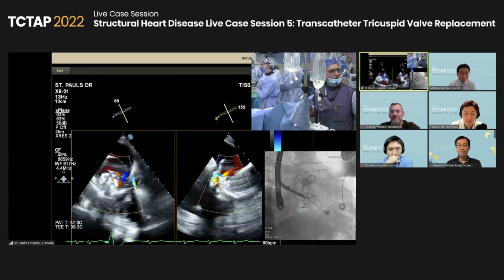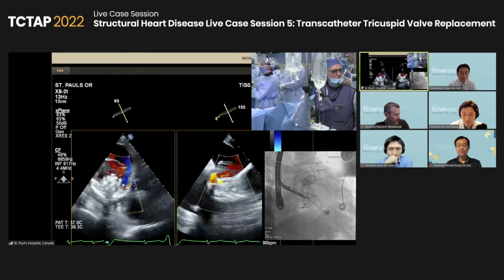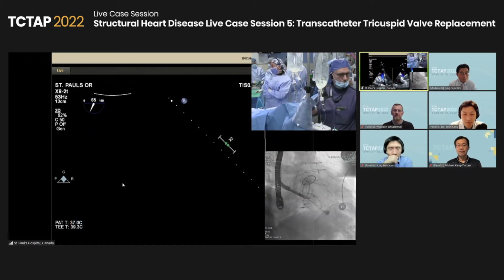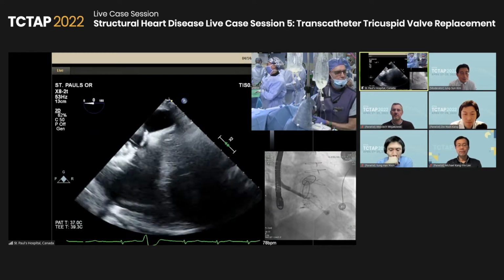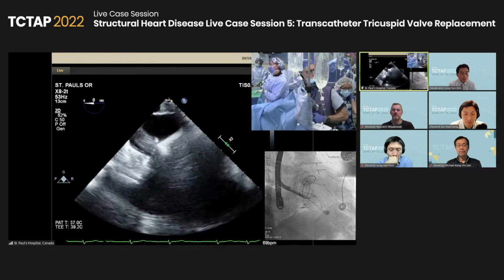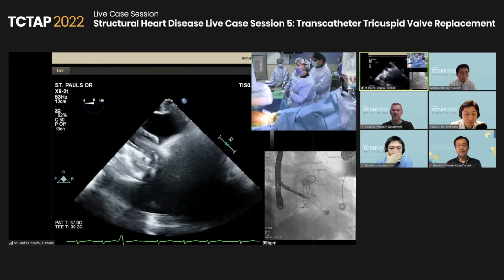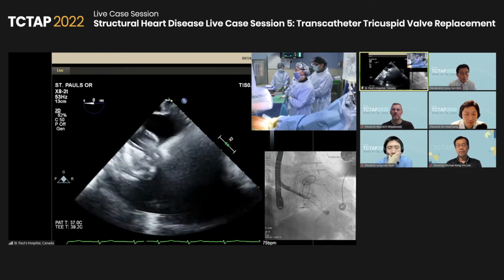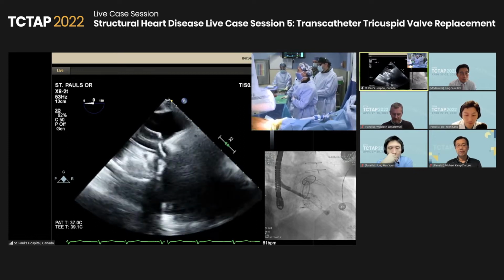I don't know if you want to try and come a bit more anterior with the device at this point. I think what we could do at the moment is go to the 0 degree view, look at the septal tongue, its contact with the septum, and then determine how to maneuver this device. The key is that the two tabs are now deployed subannular under the anterior and posterior leaflets. The next maneuver is to move towards the septum and then deploy the septal tongue. We're pretty close where we are, but we'll confirm that with the next set of images.